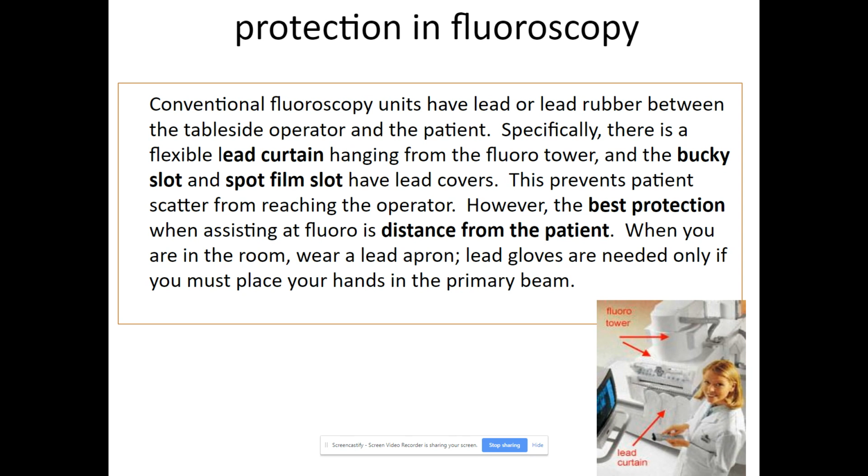So distance for you though, you would be behind the radiologist. They're wearing their apron, you're wearing your apron, everyone's wearing aprons is the point, and you maybe stand as far back as you can. But how far could you possibly be? You couldn't be like, oh, you need a spot? Toss the cassette. That doesn't really work. So radiologists are getting more radiation than radiographers. I know, right? Earn that extra zero in their paycheck each week.